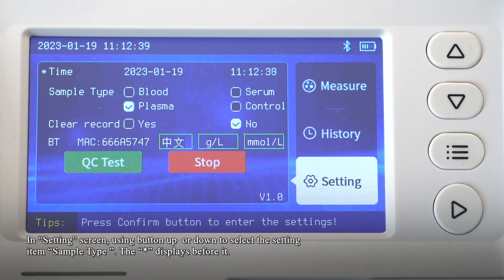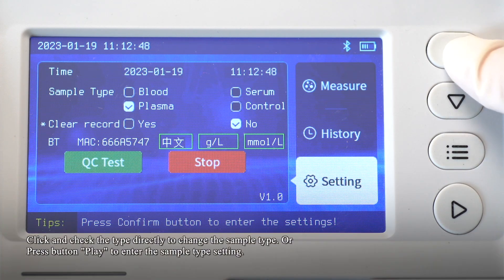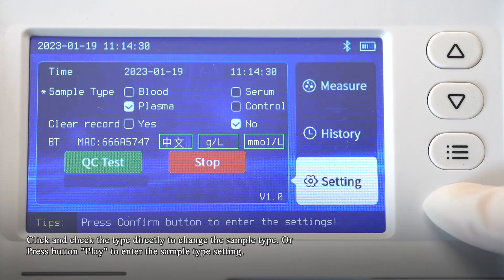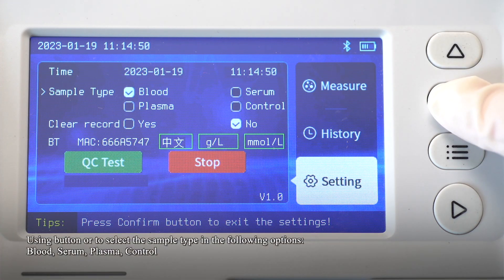In the setting screen, use the Up or Down button to select the setting item for sample type. Click and select the type directly to change the sample type, or press the button to enter the sample type setting. Use the Up or Down button to select the sample type from the following options: Blood, Serum, Plasma, or Control.